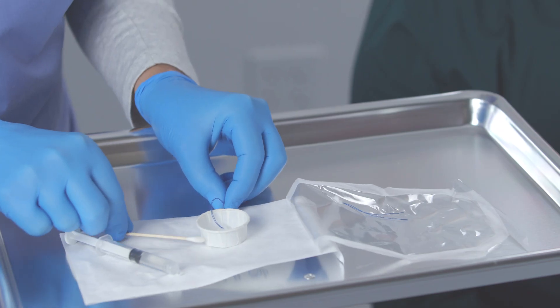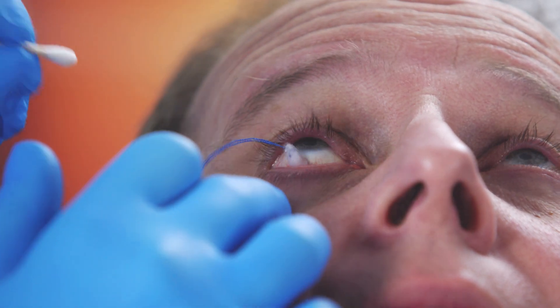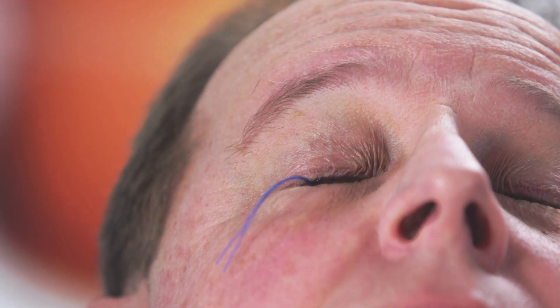With the help of the included applicator stick, remove the pledget and place it directly into the fornix. Repeat for the other eye if necessary.